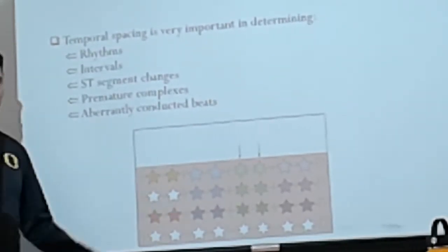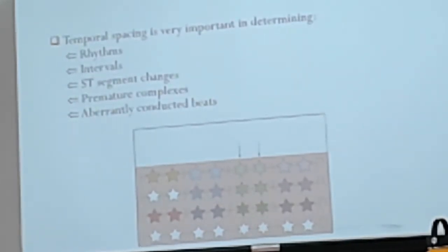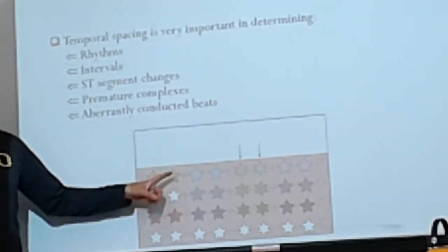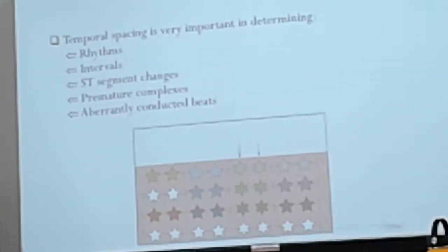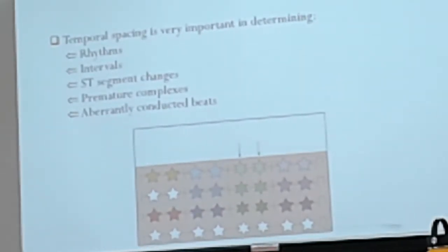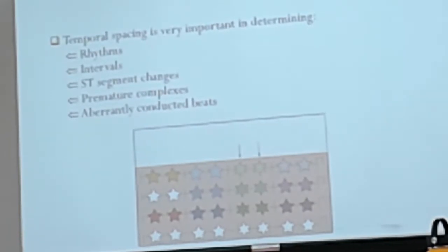Same thing with my QRS complex. If I'm trying to measure my QRS complex to find out if this is a narrow or wide QRS complex, but something funky is going on with the QRS complex in lead one, then look at the QRS complex in lead two or lead three and find out if you can see the measurement better in one of those leads. Does that make sense? It gives you the opportunity to look in other leads because you know that what's happening in another lead is happening at the same time as the lead you initially looked at.